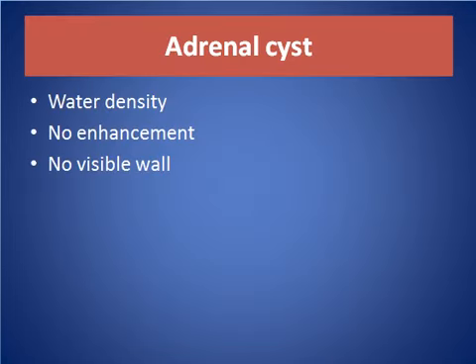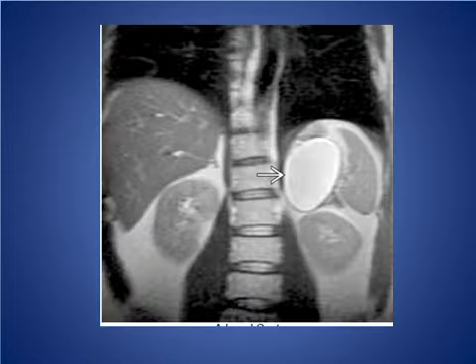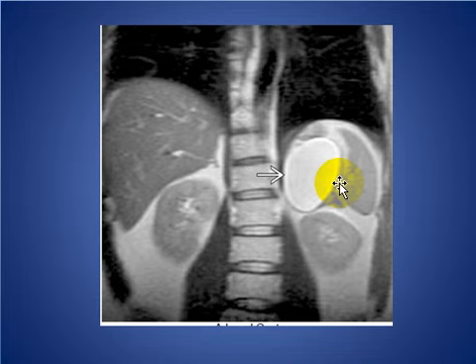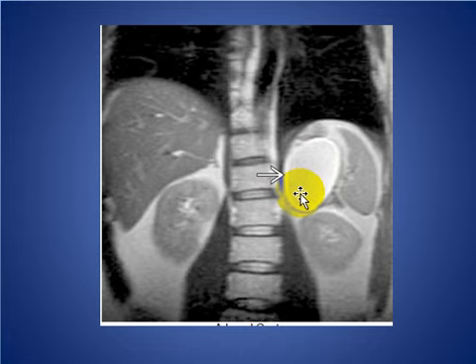Adrenal cyst: water density, no enhancement, no visible wall, no mural nodule. We have coronal T2-weighted MRI images showing a large cyst in the left adrenal gland, consistent with an adrenal cyst.